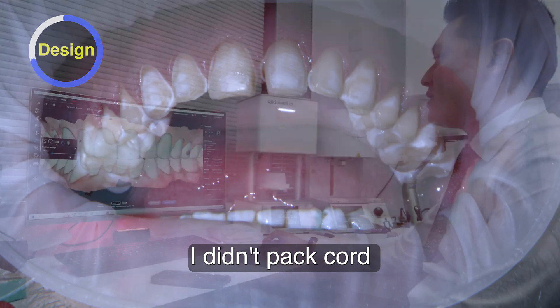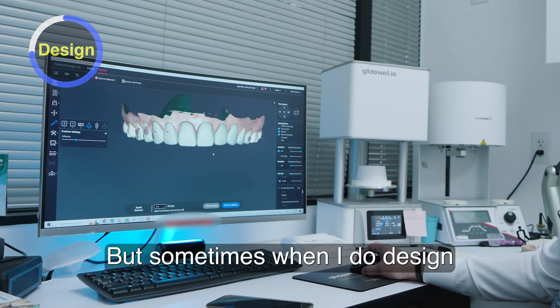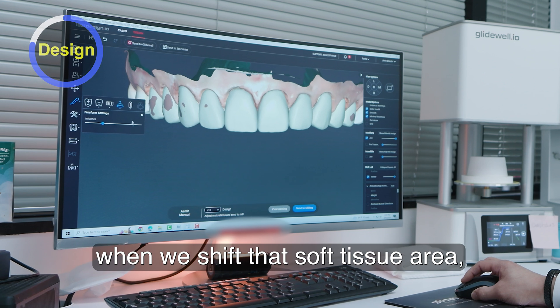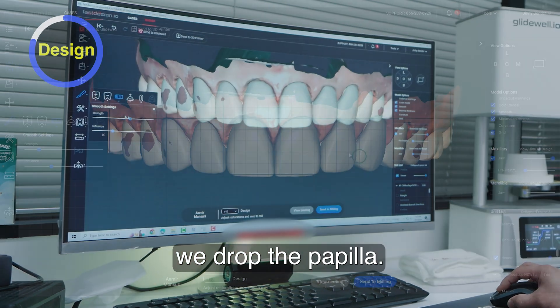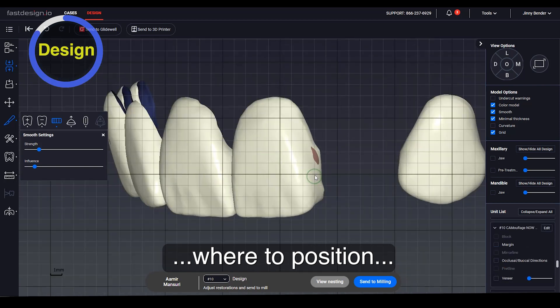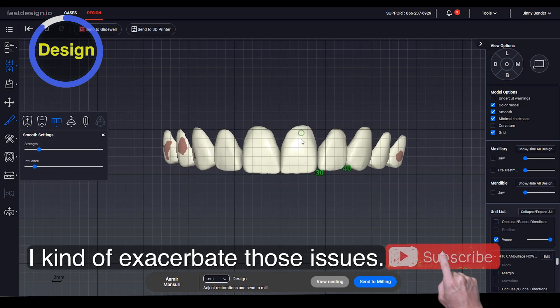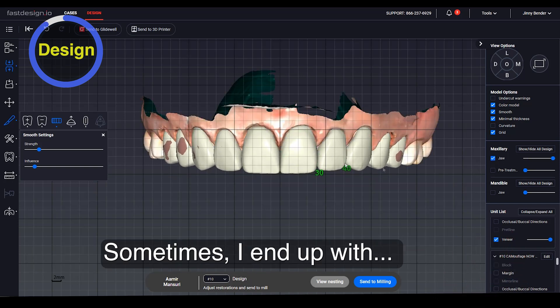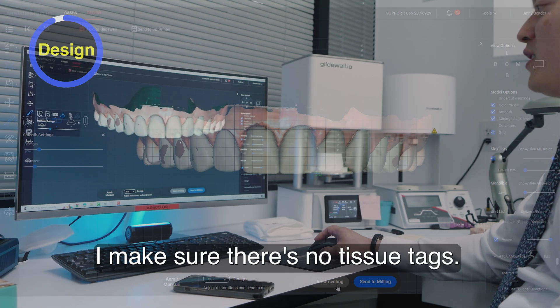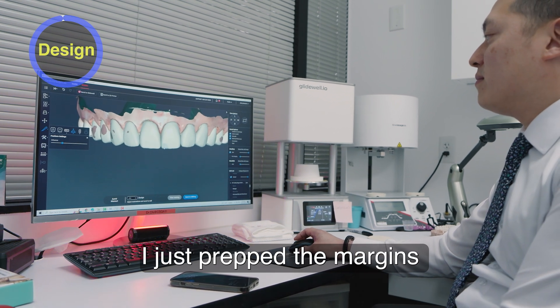For this case, I actually didn't pack cord. Sometimes when I design a lot of my anterior cases and I do pack cord, when we shift that soft tissue area and drop the papilla, sometimes I get a little unsure of where to position the emergence, how much space, and if there are any black triangles, I kind of exacerbate those issues — sometimes ending up with over-contoured zones. So before we scan it in, I make sure there are no tissue tags, all the finish lines are visible, and for this case I just prep the margins equigingivally.